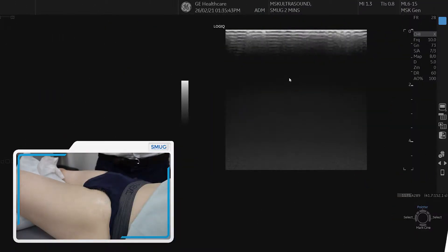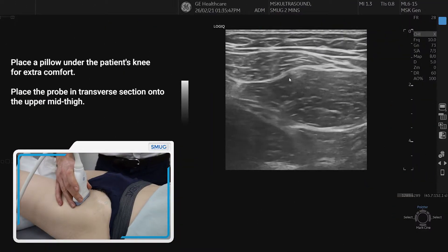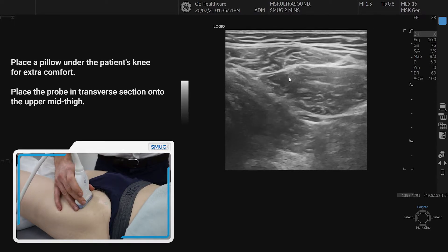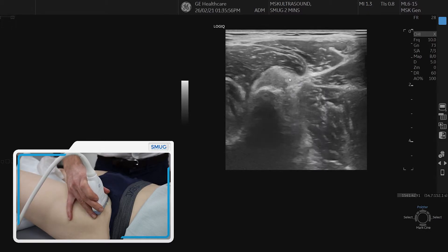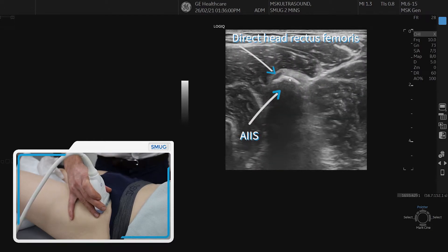To assess the anterior hip, we can put a pillow underneath the patient's knee to relax the structures at the front. First of all, we follow rectus femoris in transverse section until we see its attachment, which is the direct head, onto the top of the AIIS.